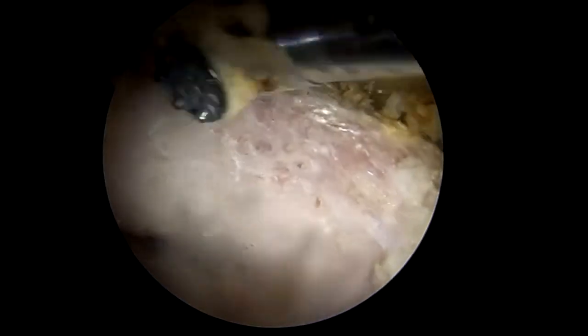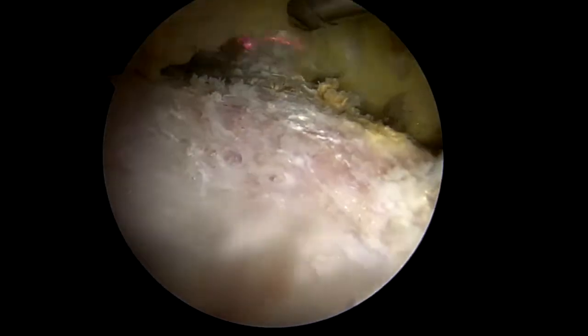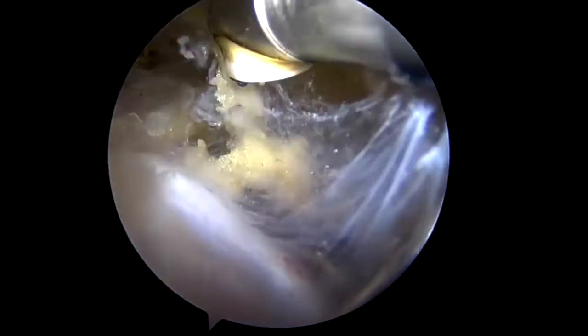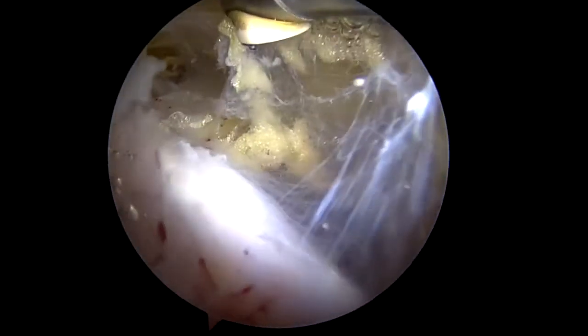Next, the superior surface of the coracoid process is debrided. Here you can see the anterior portion of the conjoint tendon and the pectoralis minor tendon, which has not been detached.